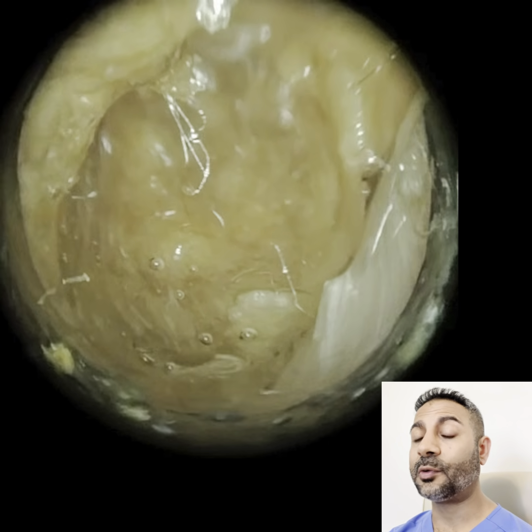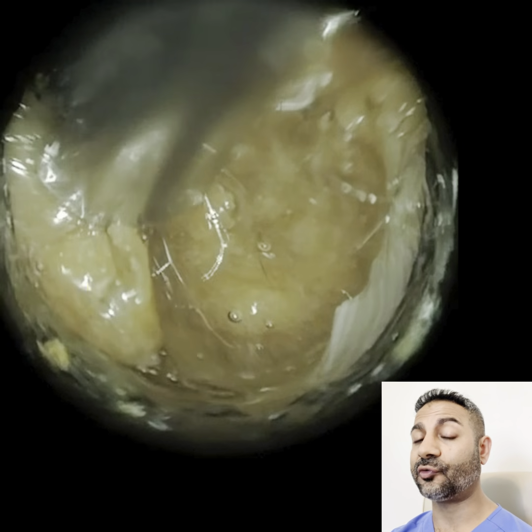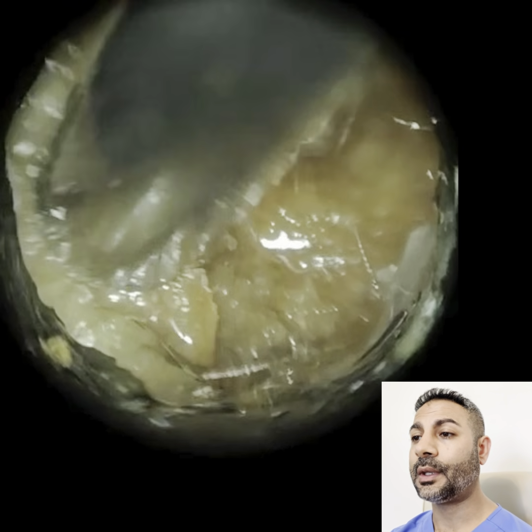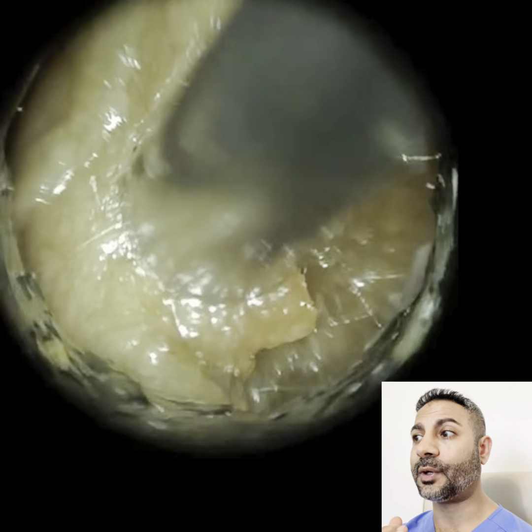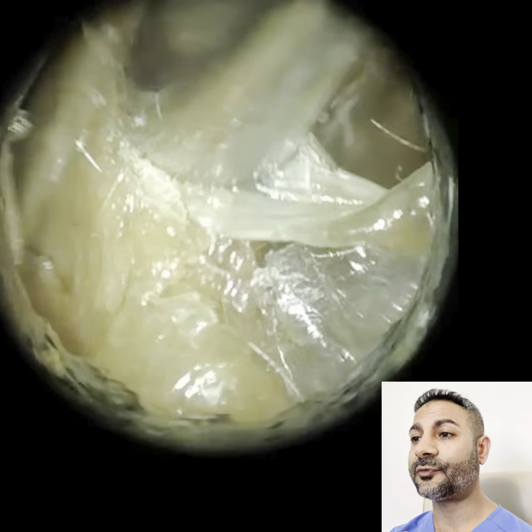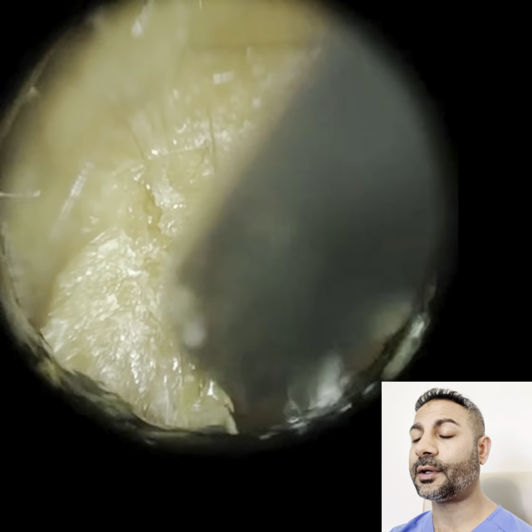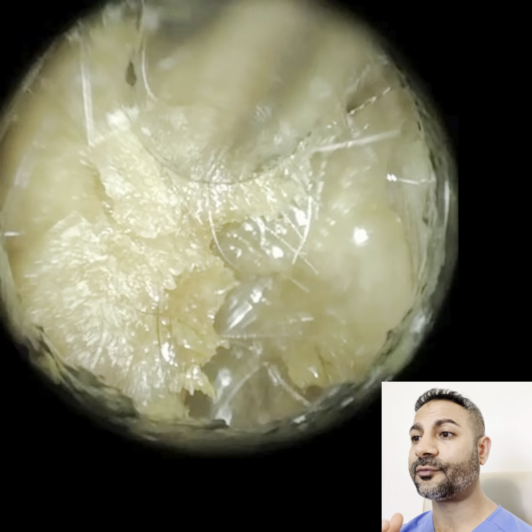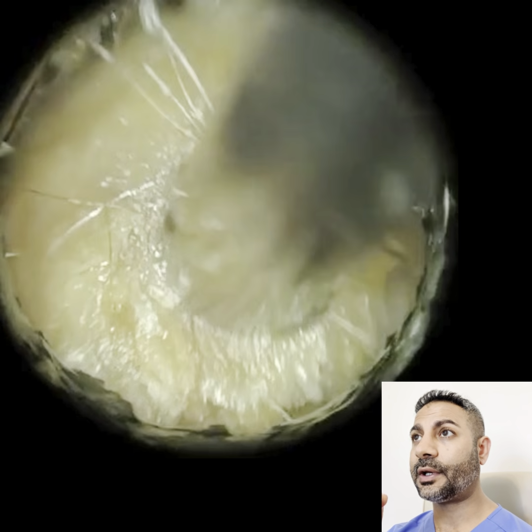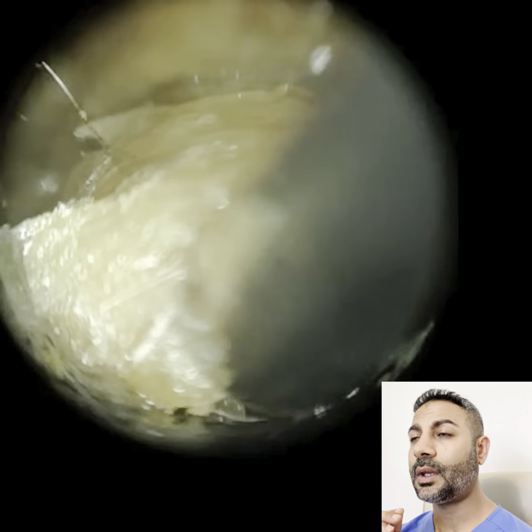So a very plausible explanation is that this patient previously had a blocked eustachian tube, which created negative pressure, and the attic region got sucked in. The eardrum, both the outer and innermost layer, is quite sticky, so it seems like it's stuck to the neck of the malleus, the scutum region. So it's like a pseudo appearance of a blocked eustachian tube because they previously had one. Now, although that eardrum is sucked in, the pressure was absolutely fine behind the eardrum.